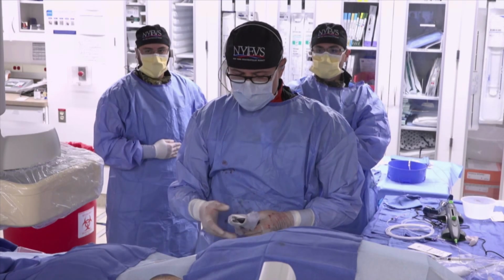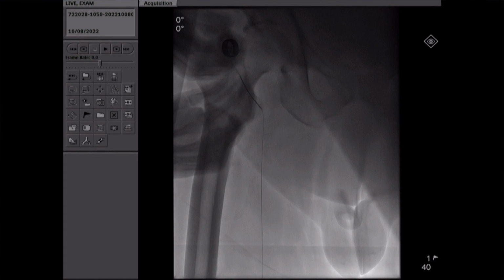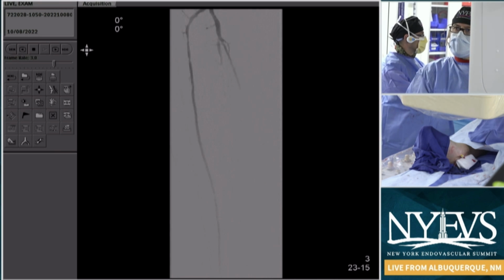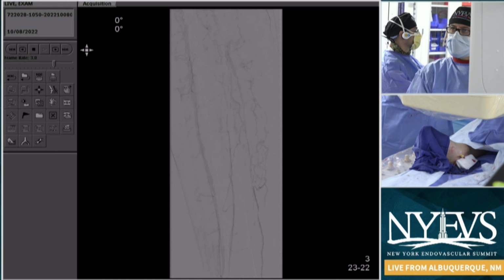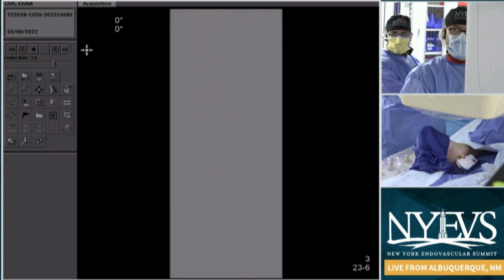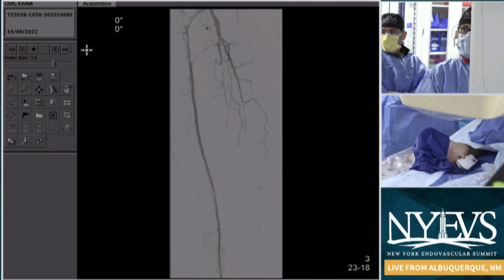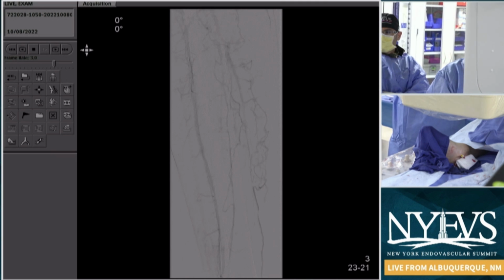So going to our angiogram here, which we did just a few seconds ago, we start with an antegrade approach. Stiff wire and the usual. You can see our beginning angiogram here. SFA, P1, P2, P3 look good. And from the outset, the top of the tibials seem to look pretty reasonable. As we zoom down, our anterior tibial looks reasonable, looks like the dominant flow vessel, with some minimal disease, but our posterior tibial and peroneal artery are diffusely diseased. But it looks like an eminently crossable lesion. These are kind of infamous because they look like chip shots on the outset, which is one of the reasons I thought this might be a good case to talk about and do in 20 or 30 minutes.